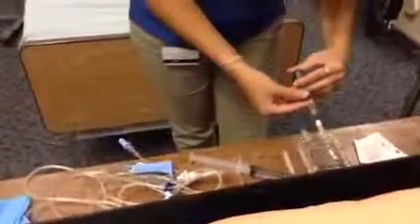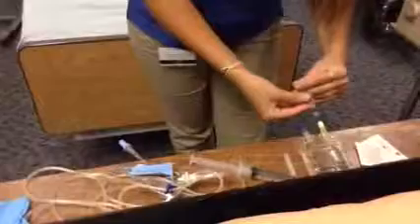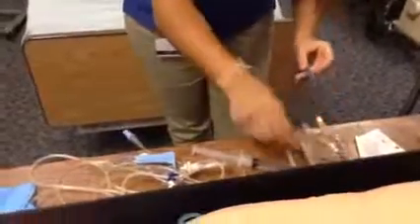You can open it up. Inserting it. And then we're going to dispose of this into the sharps container. We're going to mix the medication up.